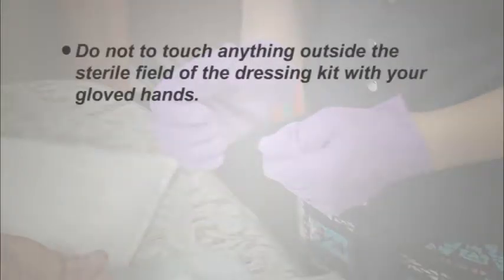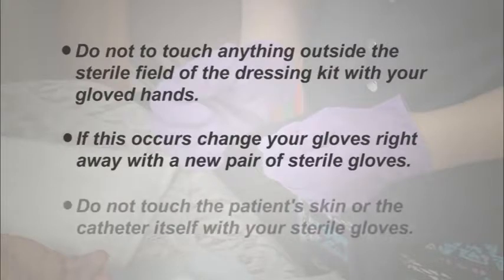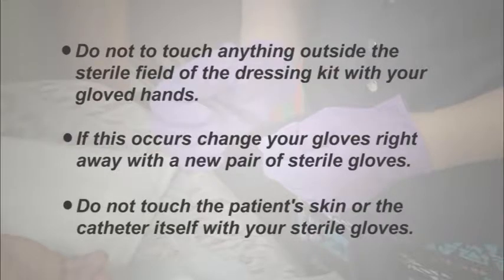Be careful not to touch anything outside the sterile field of the dressing kit with your gloved hands. If this occurs, change your gloves right away with a new pair of sterile gloves. This includes not touching the patient's skin or the catheter itself with your sterile gloves.